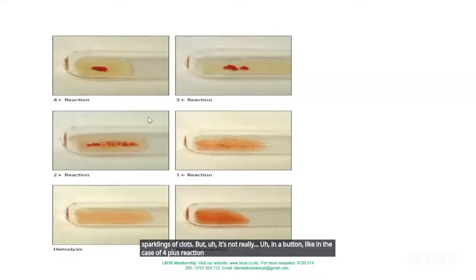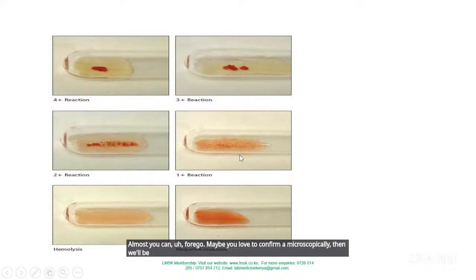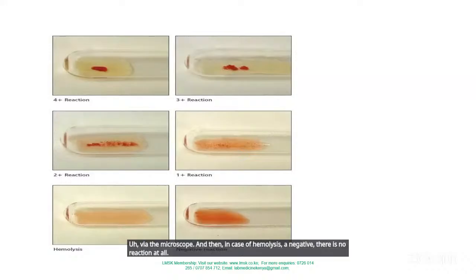And then in 1+, where almost you can forgo, maybe you'll have to confirm microscopically, then we'll be able to see agglutinations via the microscope. And then in the case of hemolysis and negative, there is no reaction at all. So that's how it looks in the lab.